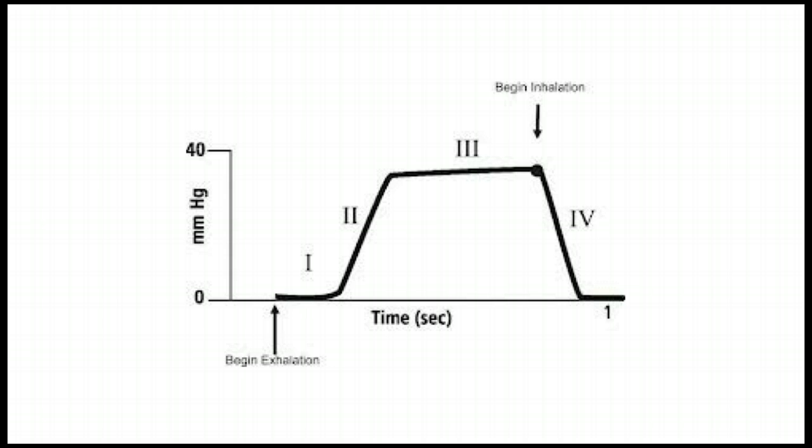So on a capnography waveform, it makes sense when you first start to exhale, you're only exhaling dead space, which has a concentration of CO2 of zero. As you're exhaling more, the concentration of CO2 increases to the point where it hits a plateau, and this is essentially the alveolar concentration, or the highest amount of CO2. Basically, right before you inhale, you hit this point called the end-tidal CO2, and that's the number we care about in cardiac arrest.